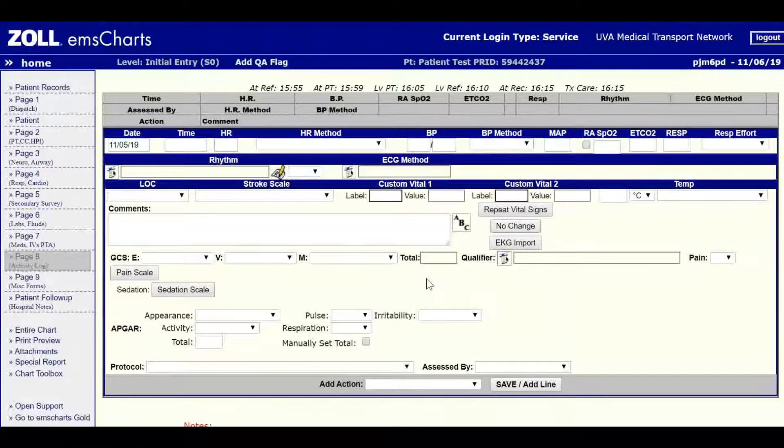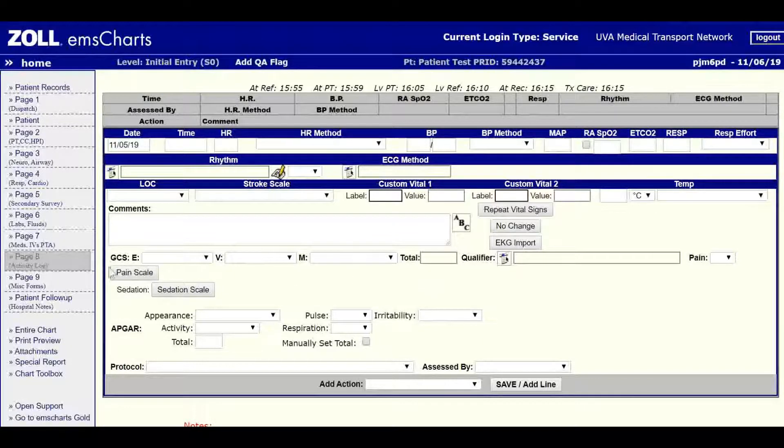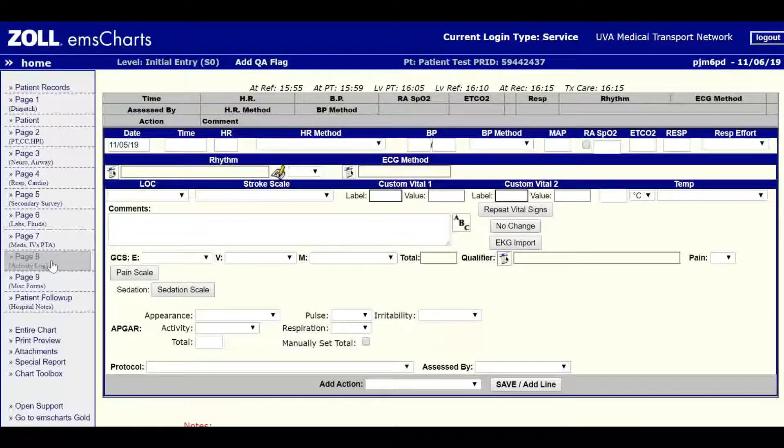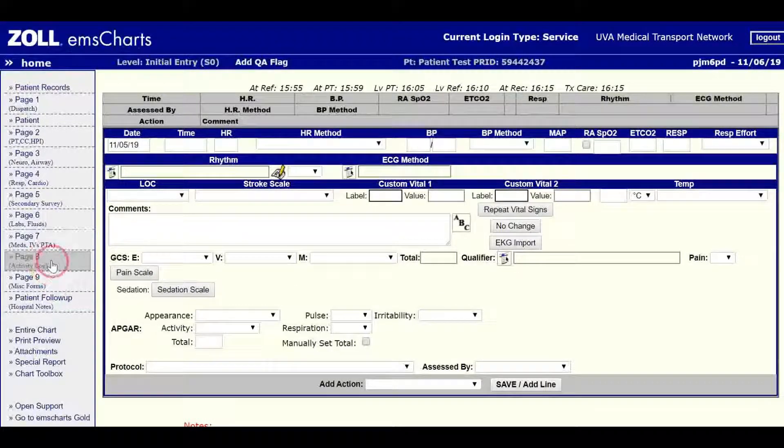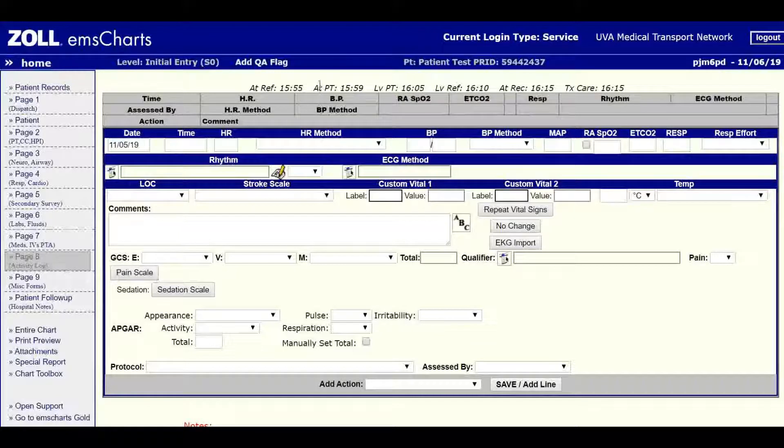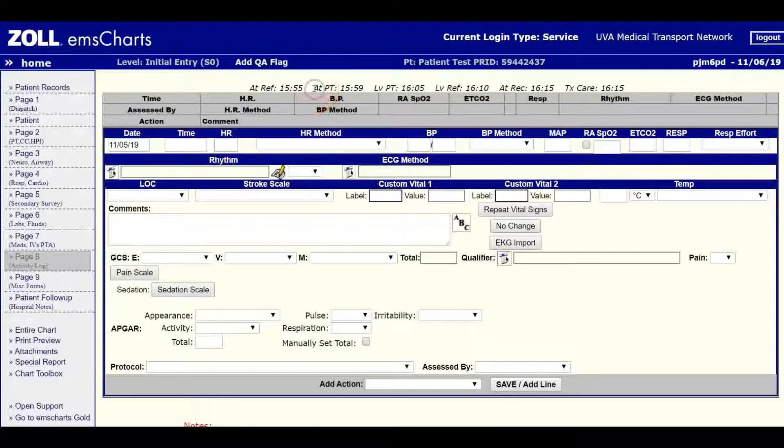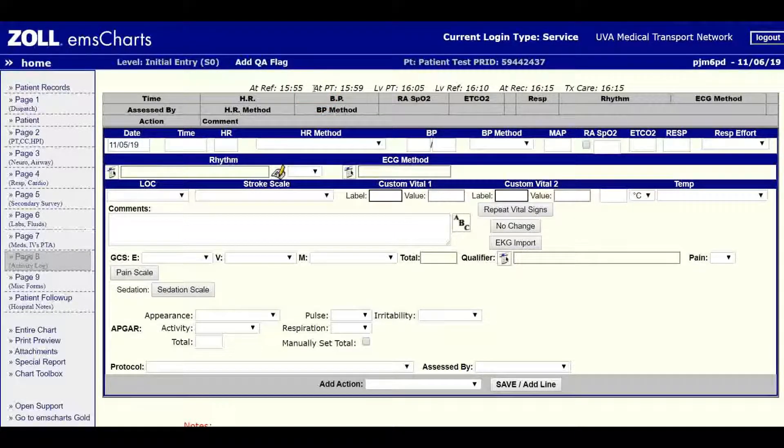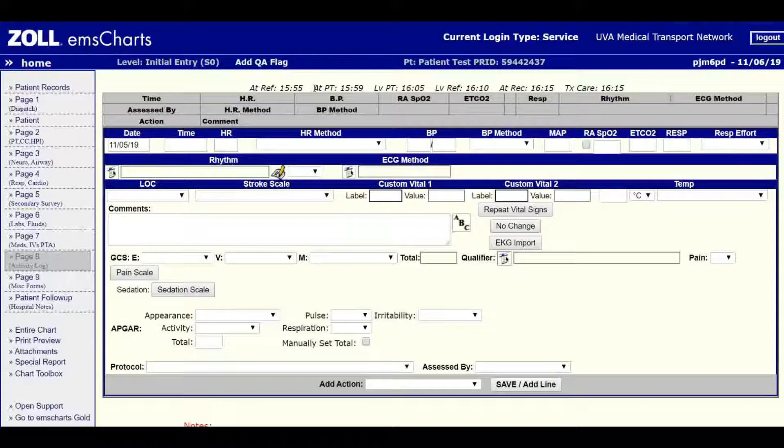On EMS Charts, you'll import from page 8, so you'll want to make sure you're on page 8, the activity log. Then we're going to take note of our at patient time or our on scene time, because we're going to want to reference this later when we look at our trends.